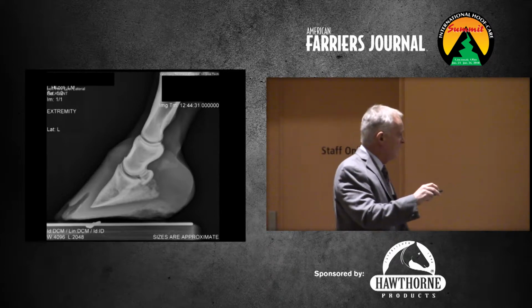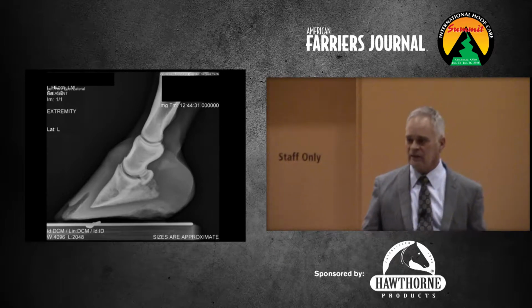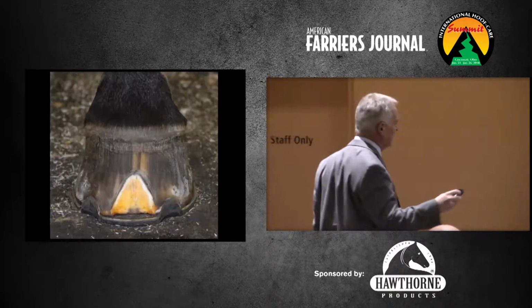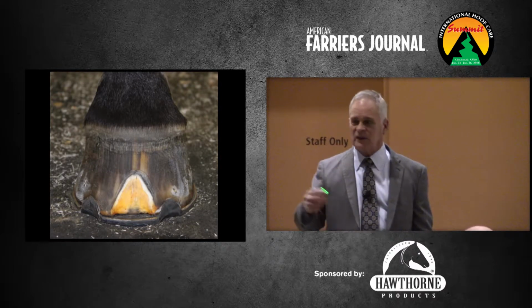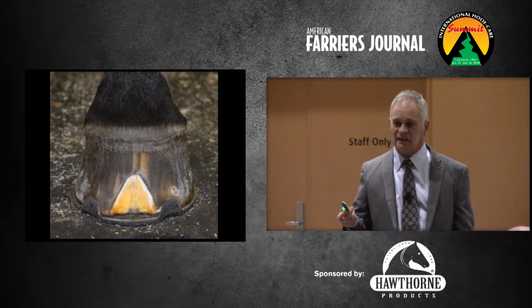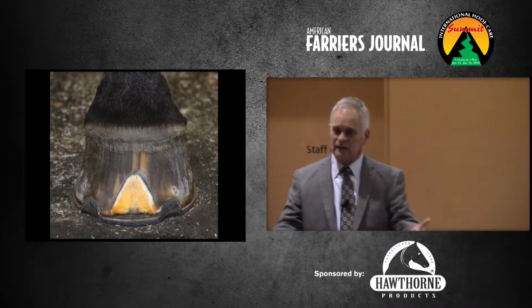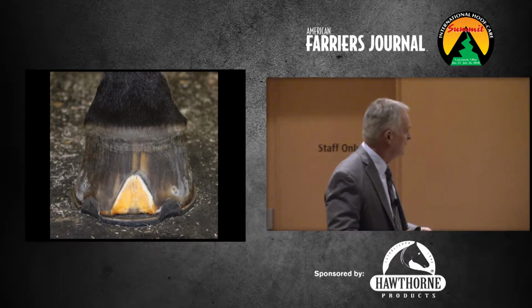All right, so now with confidence you can tell the owner, we need to get all that off. That's the only way this is going to get better. We've been trying it conservatively. They usually accept that better than if they just came home and that's what their foot looked like. Some of your clients will let you do that, but others are going to be stunned or shocked and call Dr. Pleasant and say, I can't believe what my farrier did. So having that information supports what you want to do, and that's very important.